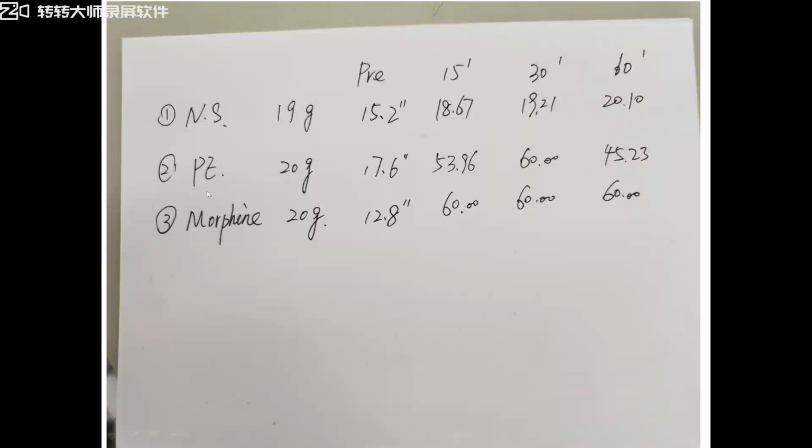Okay, so we tested the pain threshold repeatedly. After injecting the different drugs for 15 minutes, we tested the pain threshold again. And we also observed the pain threshold 30 minutes and 60 minutes after we injected the different drugs. So let's see the results.